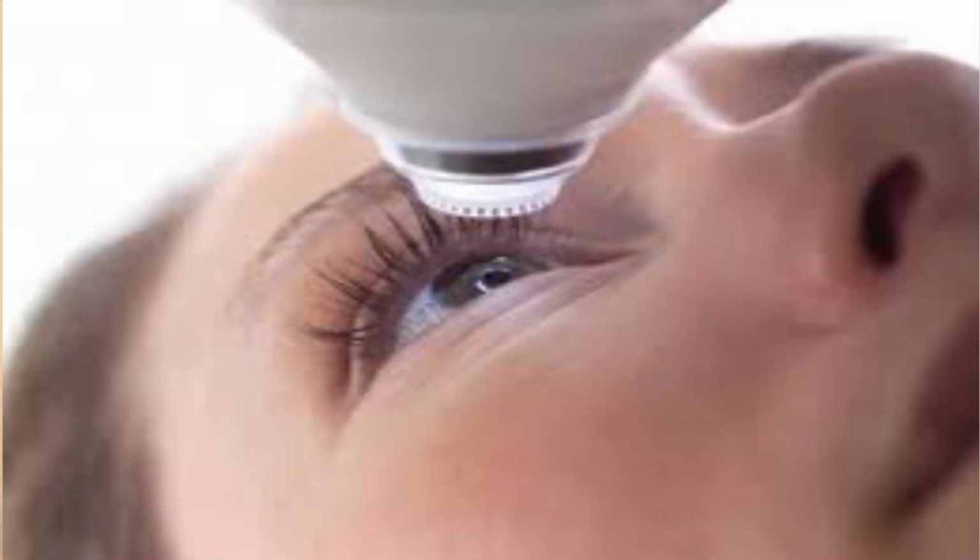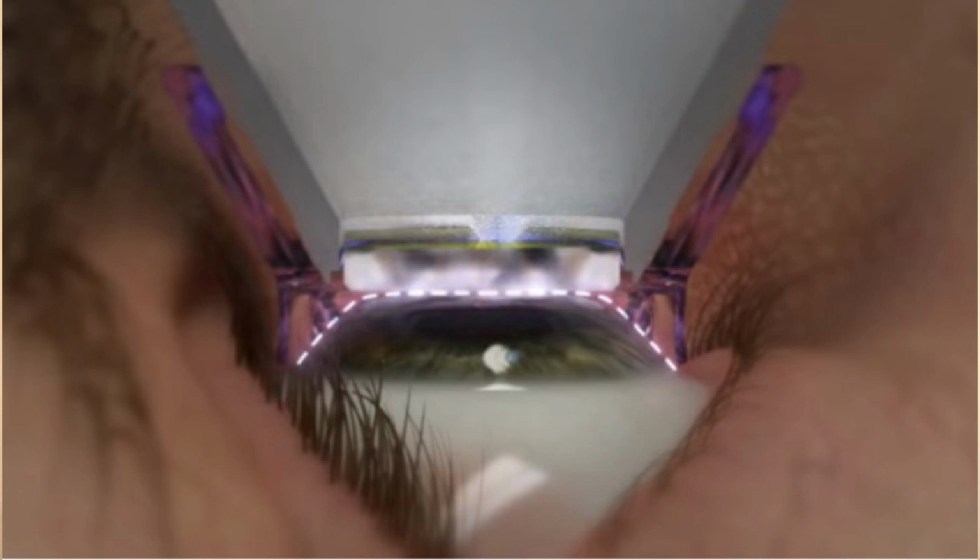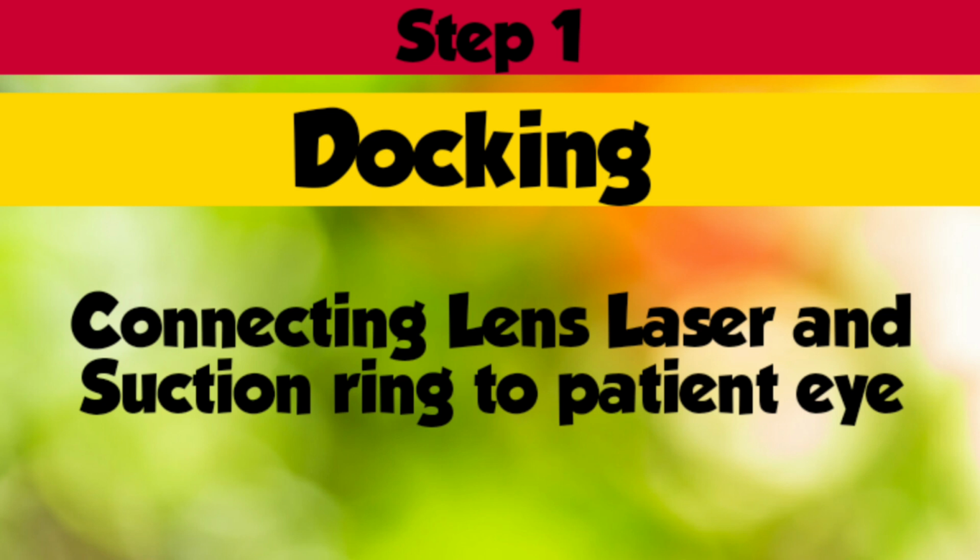So what is the docking mechanism? Docking actually means to flatten the corneal surface, or applanate the corneal surface artificially. How do we artificially applanate the corneal surface? It involves a system that includes a suction ring that is applied to the limbal area. After applying the suction ring, we hold the eye, and there is another lens system, smaller in size than the docking suction ring, that fits into that ring and flattens the cornea artificially. The purpose of this step is mainly to flatten the cornea so we can create a uniform flap.